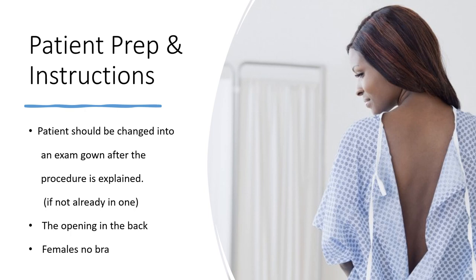Patient prep and instructions. Patients should be changed into an exam gown after the procedure is explained, if not already in a gown. The opening should be in the back. Females should be asked to take their bra off. You can take an extra towel and tuck around their underwear and slide it down to protect their garments so they don't get any iodine on there.